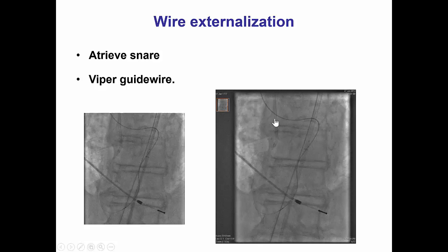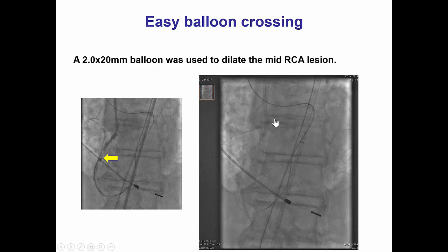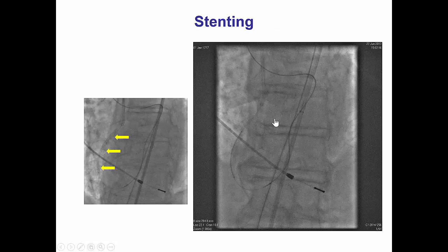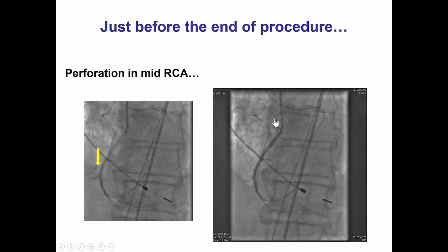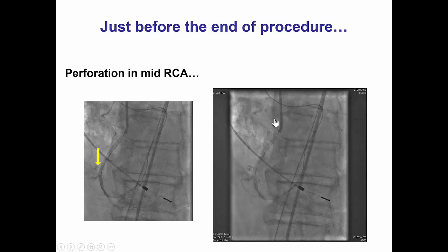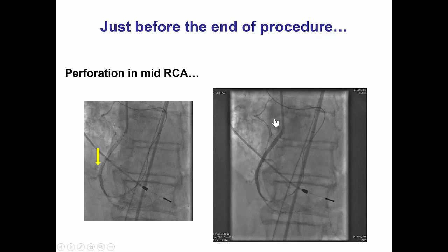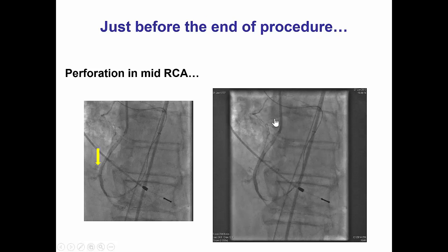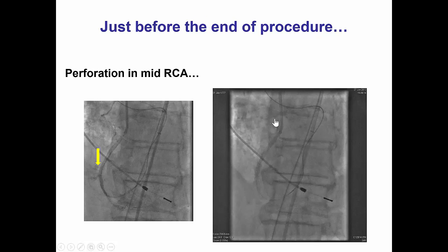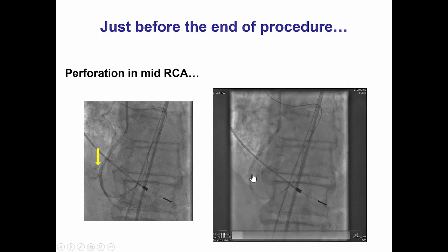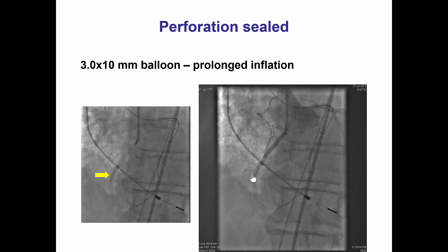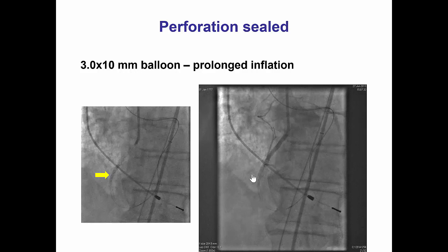The wire was externalized, and then the right coronary was predilated. There was extensive dissection, followed by placement of drug-eluting stents. We post-dilated the drug-eluting stents with a non-compliant balloon, and we did have some staining around the stents suggesting a small perforation. However, this resolved after prolonged balloon inflation with a 3 mm balloon.